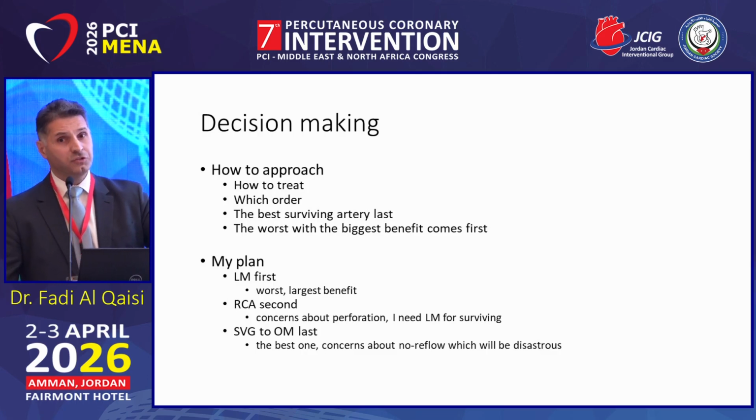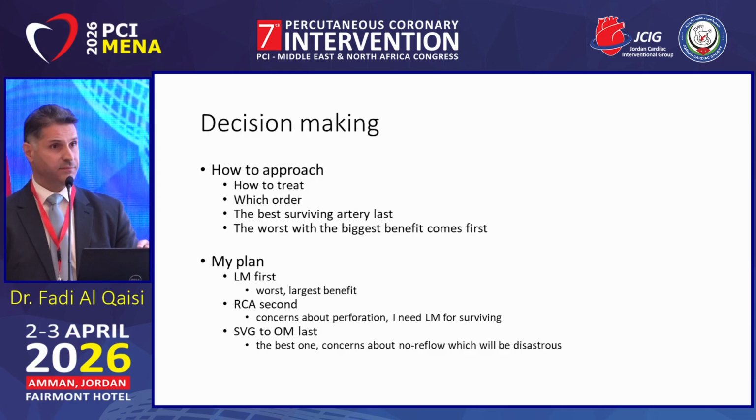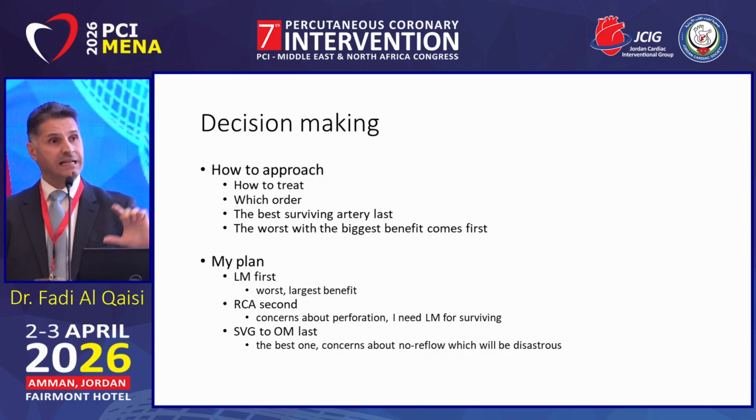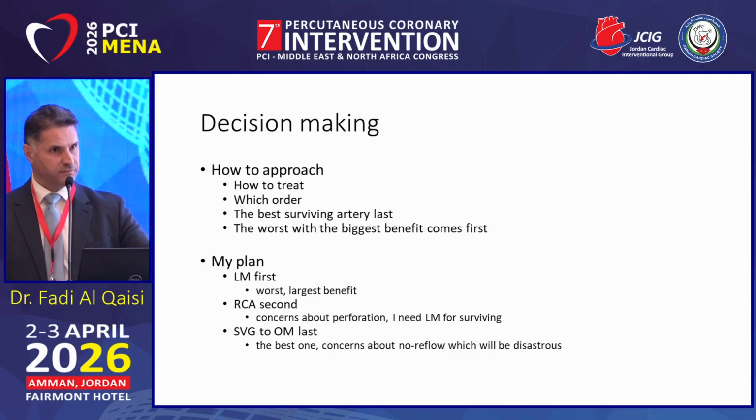The artery that contributes the least, I thought, was the left main and the LAD. Yet, if I fix that, it will give me the biggest delta of benefit. So, this was my plan. Do the left main first. Obviously, it's the worst one with the largest benefit.